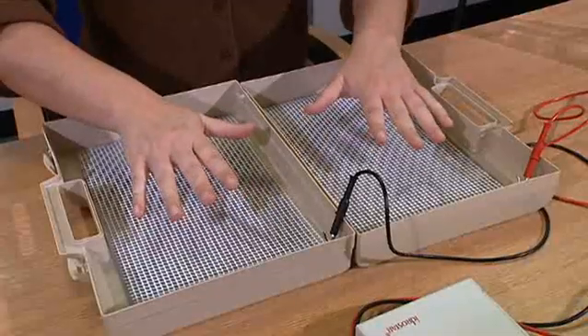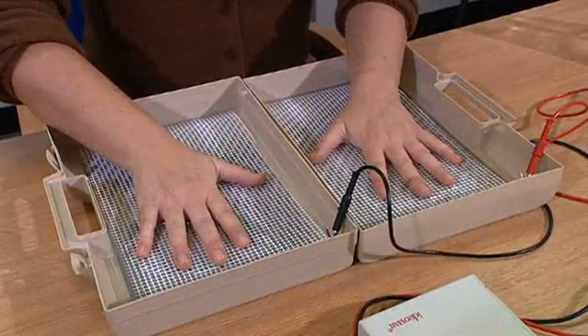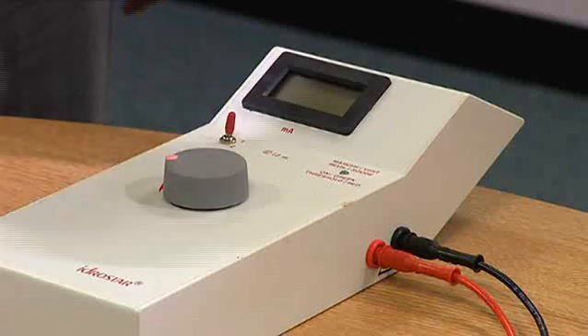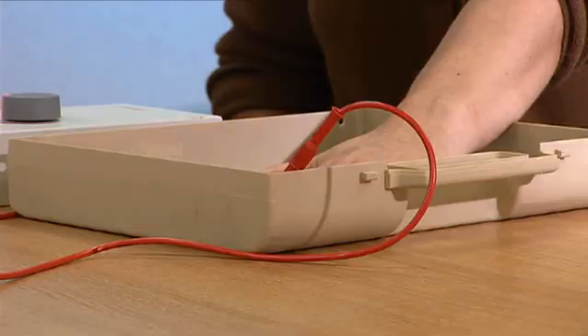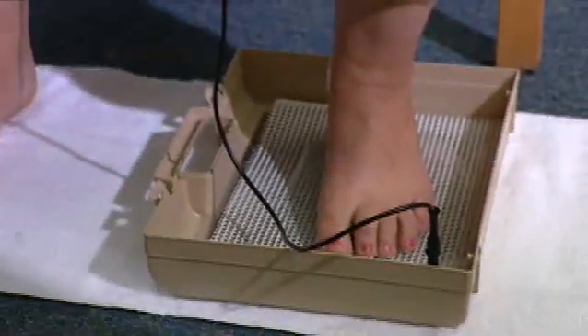Remove all jewellery before treatment commences. The current from iontophoresis machines never travels above the neck, so earrings, fillings, and braces for teeth are not a contraindication. It is important to cover small cuts with a layer of petroleum jelly such as Vaseline first. The hands or feet should remain in the baths of water at all times and should not be removed whilst the power is on.